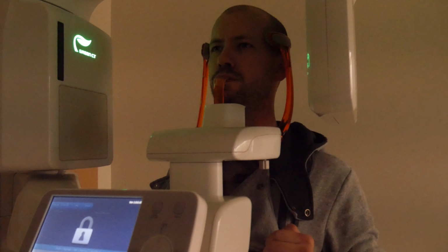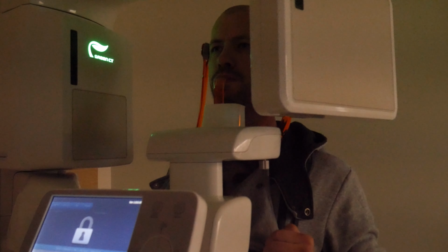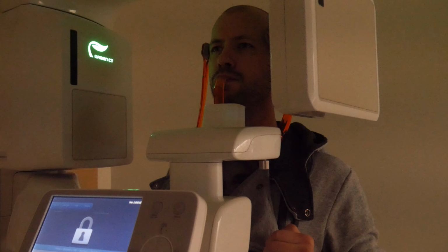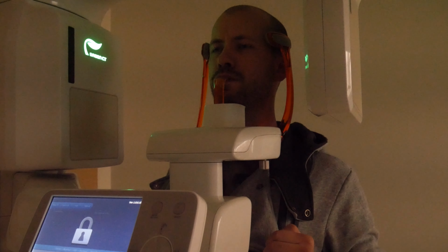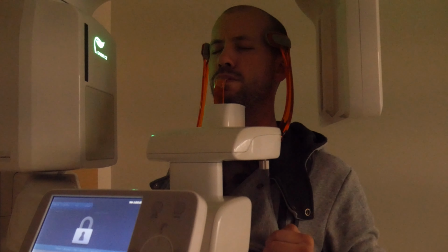The system is moving into capturing position. Please wait. The system is ready to capture an image. Please close your eyes until image capturing is complete.